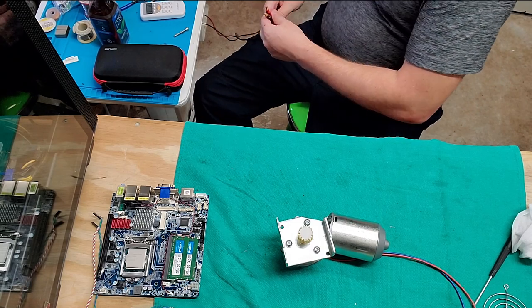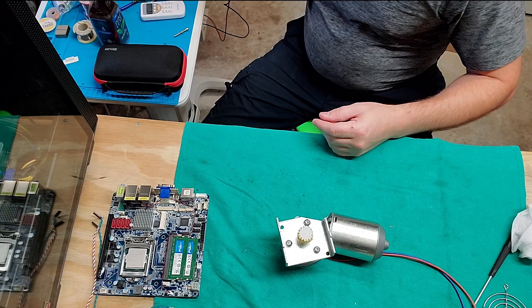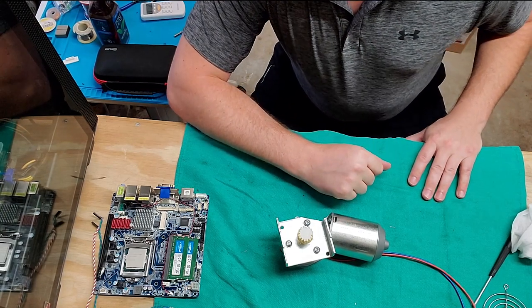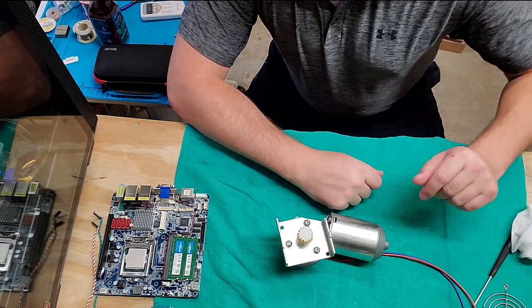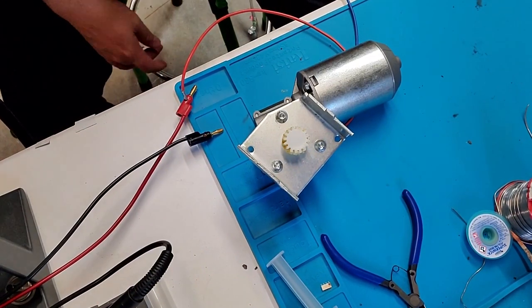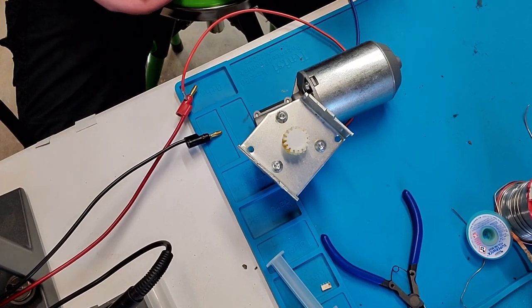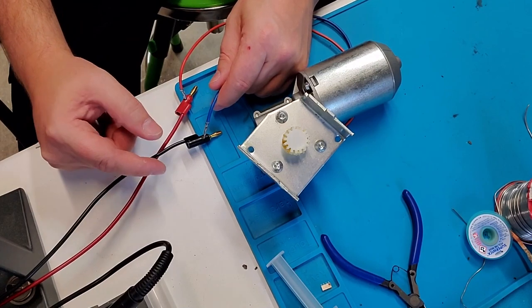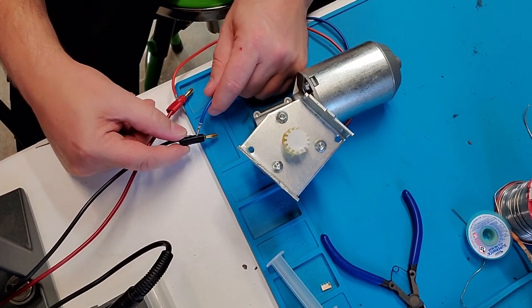All right, let's see. We've got our power supply. Let's go ahead and move the motor over to this next window so that you can see it running. I'm thinking it's going to run absolutely fine. We're going to find out together. Here we go. I've got my power supply set at 12.7 volts DC. It should be self-explanatory, right? Black to negative, red to positive. Let's go ahead and check it out.